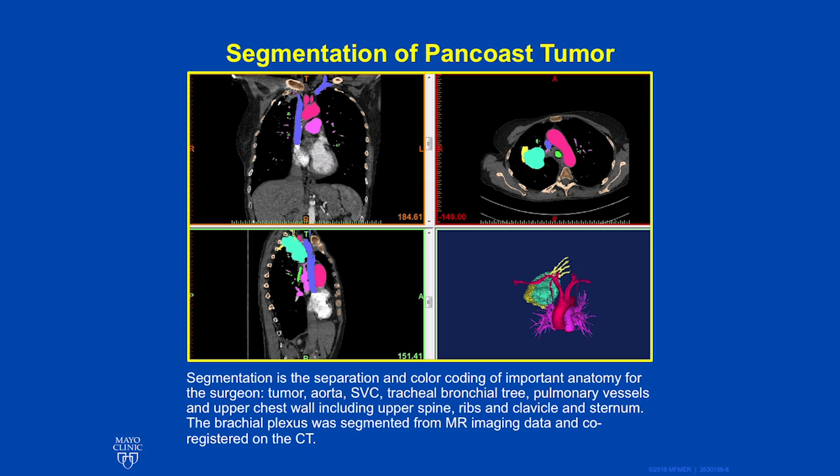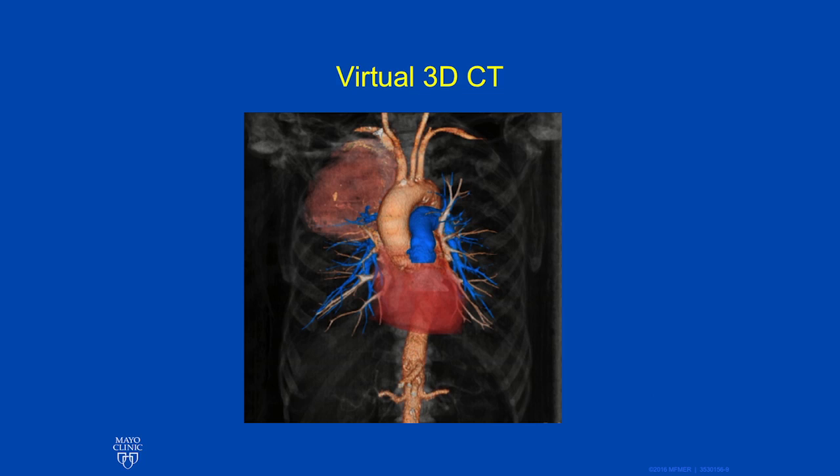This initial process of segmentation involves selecting the things that you want to segment and print. After each organ or specific item of interest has been selected, it is then used to create a separate STL file, and those STL files are then fused together. We convert the images imported into 3 planes. This first step is very similar to creating a 3D image from existing software without formal preparation or printing that many people already have in their hospital.